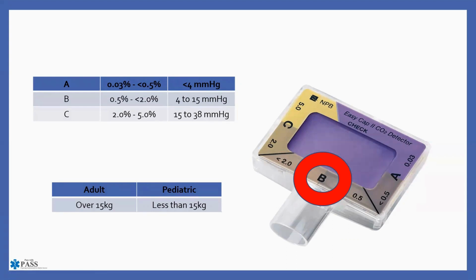Once we've intubated the patient, we take the adult cap and put it on top of a pediatric tube. There is only so much dead space in the pediatric anatomy. When that individual exhales, the gas, which is CO2, comes up and hits this cap. But there's so much potential space in this cap, as it relates to a pediatric patient's airway and dead space, that when we squeeze the bag the second time, we are now pushing this CO2 back down into the patient's lung. It doesn't have the ability to dissipate and off-gas from the cap if we're using the wrong size cap. So we can create hypercarbia.